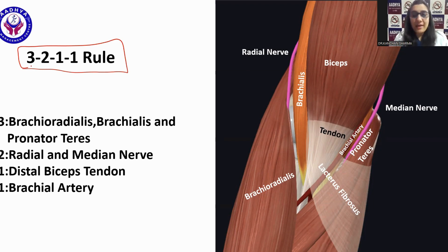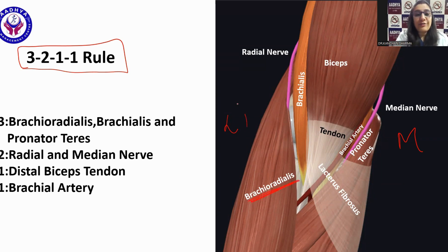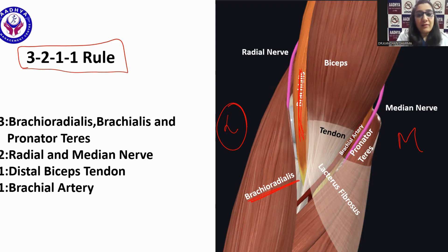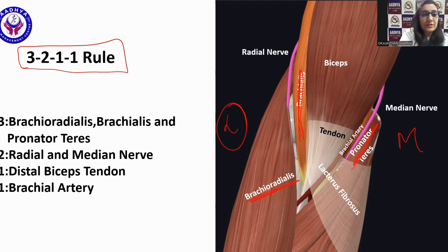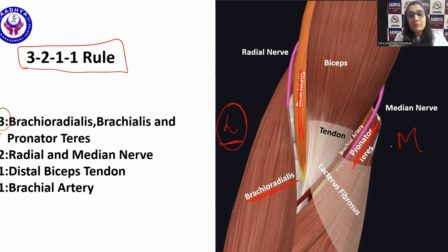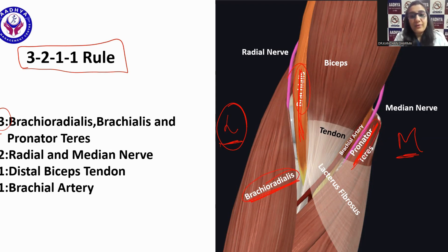The 3 in the rule stands for 3 muscles. On the lateral side we have the brachioradialis, in between is the brachialis, and on the medial side we have the pronator teres. So from lateral to medial: brachioradialis, brachialis, and pronator teres.